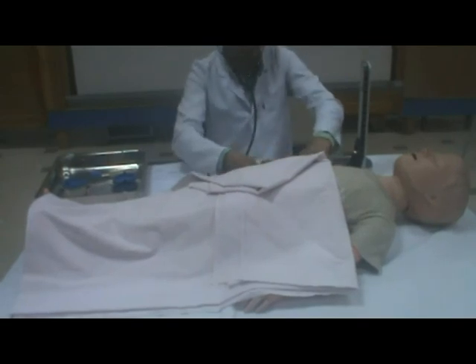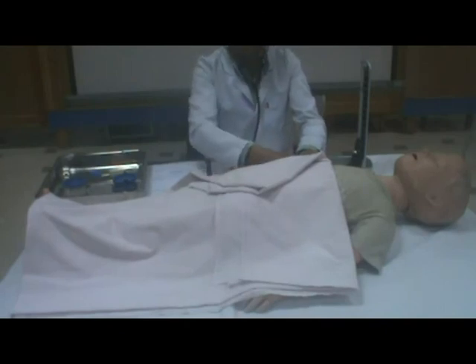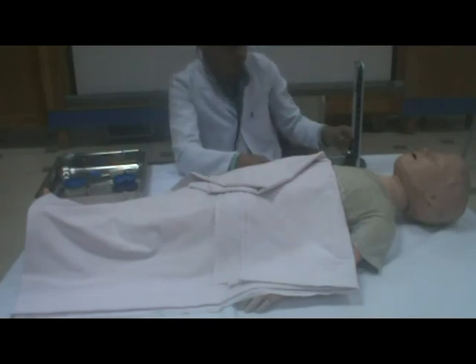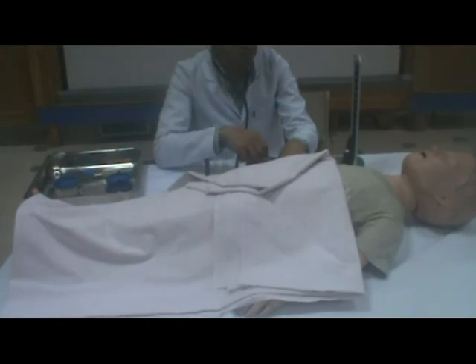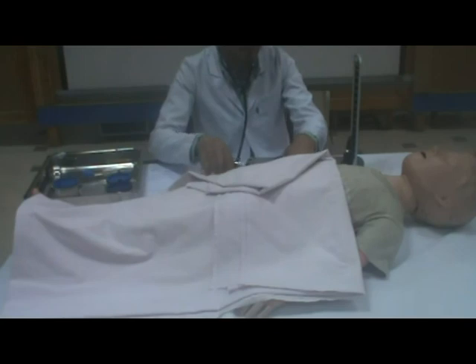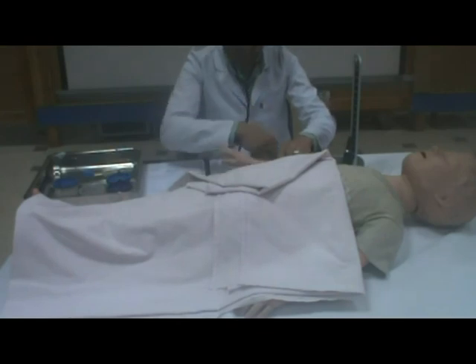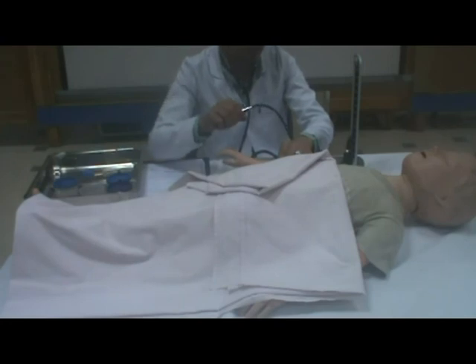With the cuff fully deflated, wrap the cuff evenly around the upper arm, as a loose-fitting cuff causes a false high reading. Be sure that the manometer is positioned vertically at the eye level of the observer, no further than 1 meter away, to ensure accurate reading of the mercury level. Palpate the brachial or radial artery with fingertips of one hand while inflating the cuff rapidly to 20 millimeters of mercury above the point at which the pulse disappears.